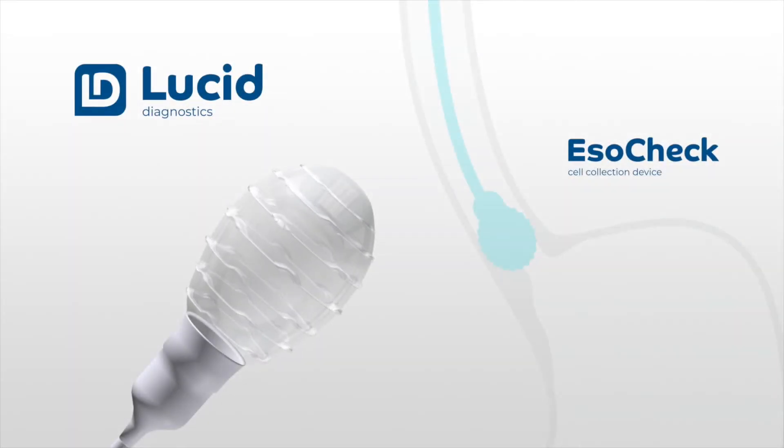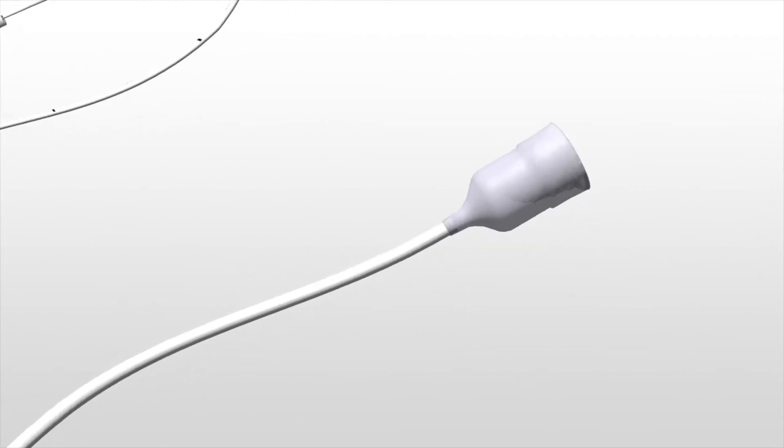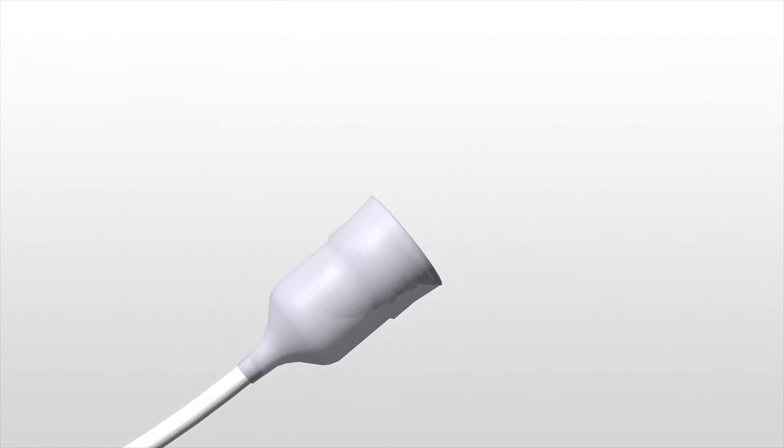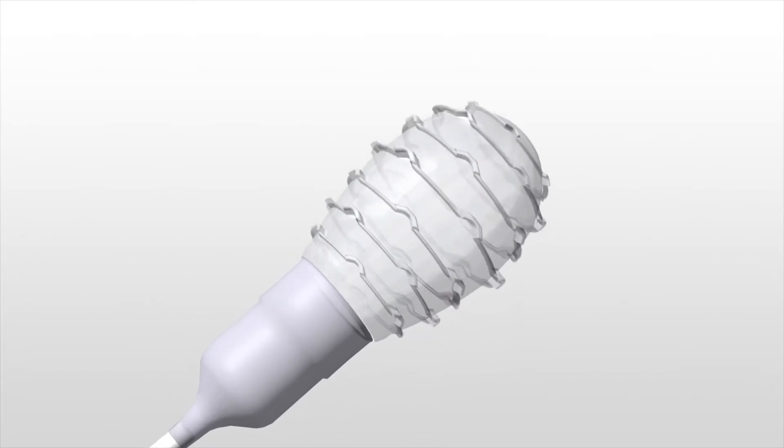ESOCHECK is a non-invasive, five-minute, office-based procedure to collect cells from a targeted region of the esophagus without the need for endoscopy. The sampled cells can then be analyzed using any commercially available diagnostic test.